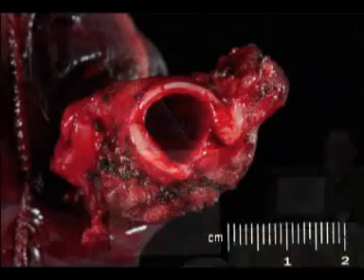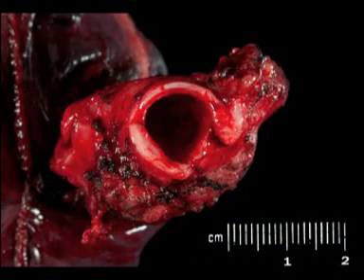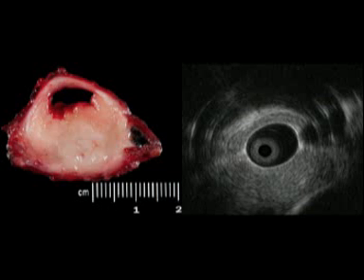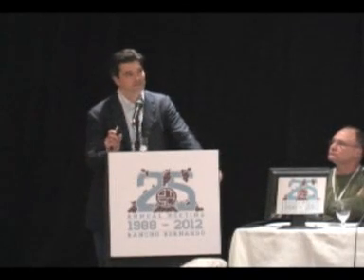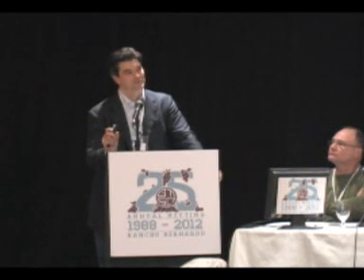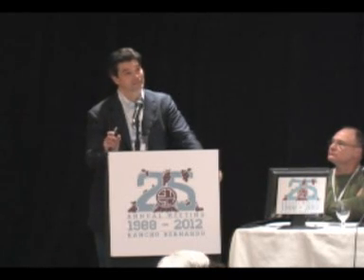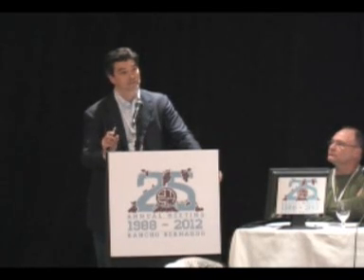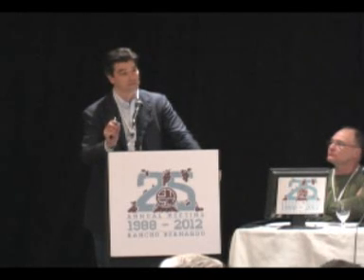Next. Gross specimen, you can see correlates with what we saw in the ultrasound. Next. And here in cross-section. I will tell you that this patient, we believed, had at least 2 centimeters of normal tissue between the carina and where the tumor began, but being adenoid cystic, it was actually 5 millimeters away from the carina. So the radial ultrasound was unable to help us determine that small amount of submucosal invasion.